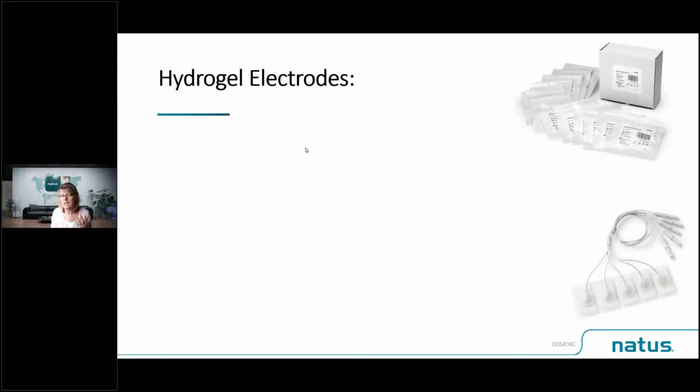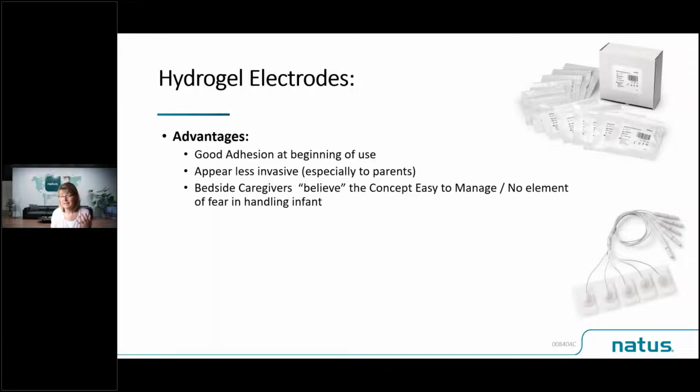So I'm going to start with the hydrogel electrodes. The advantages of them, they have very good adhesion when we start to use them. They can appear less invasive, especially to parents if they think there's just something stuck on the baby's head. They're very similar to the EKG, ECG electrodes. We're just sticking electrodes somewhere else.